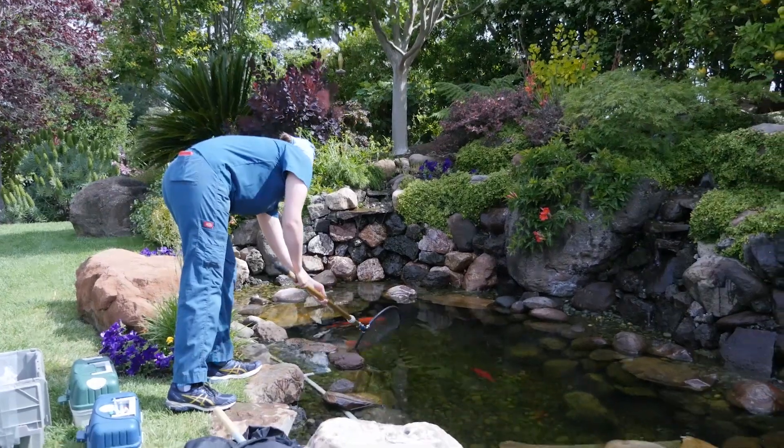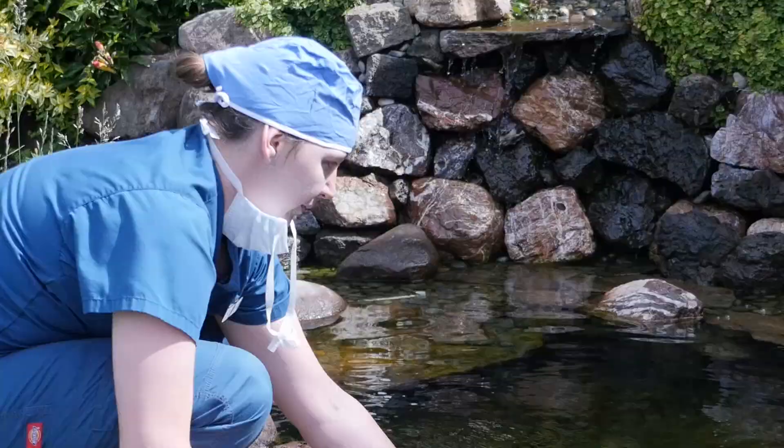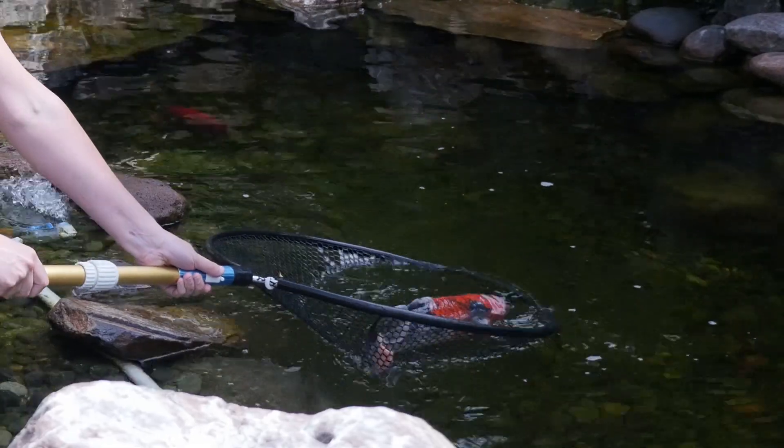Today we did an enucleation, which is just a technical term for taking out an eyeball, and a blood draw on a koi. They've been lethargic and not quite acting right, so we want to make sure that there's no internal infection going on, because we've treated them for parasites and it didn't seem to resolve the issue, and the water quality looks just fine.